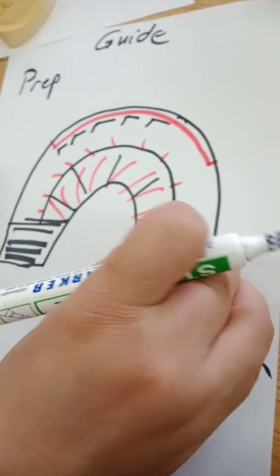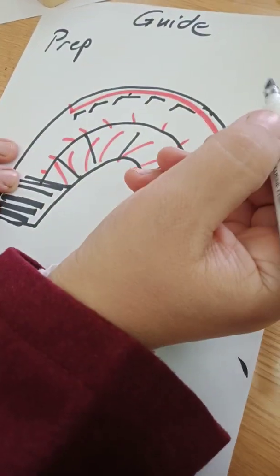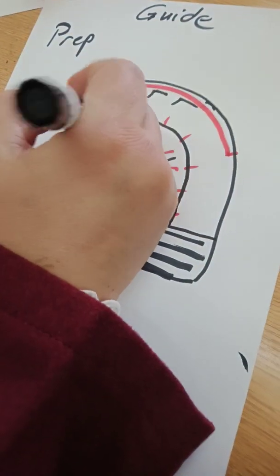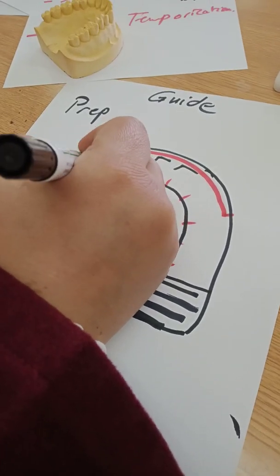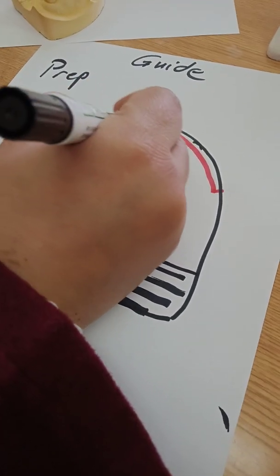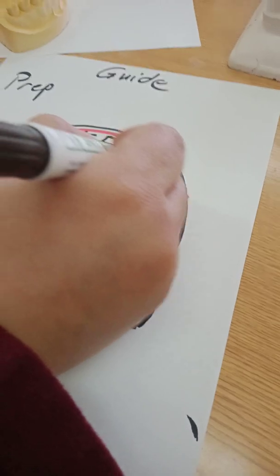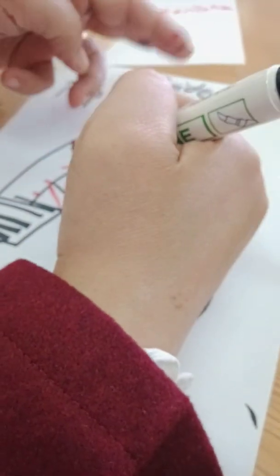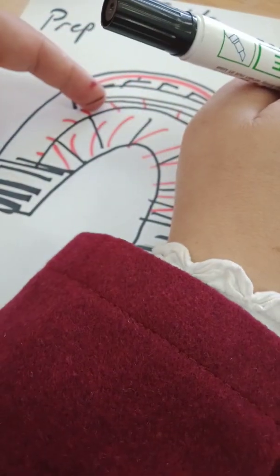So now what do I have? I have a slot. I have this intact over the molars, going around the molars here and here. Then I have a labial half only of the index, and this index is reduced 1 millimeter above the incisal edges. Now this index itself, I begin cutting it. I make a slot, leaving some material to support, but this slot is open. I will open 1 millimeter above the incisal edge, in the middle of the incisal edges, and 1 millimeter above the marginal gingiva. What will I get? This begins opening like flaps. So I would judge my incisal index, my gingival mid preparation, and my gingival preparation.